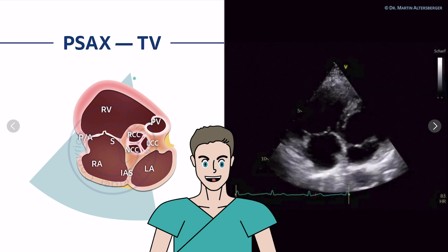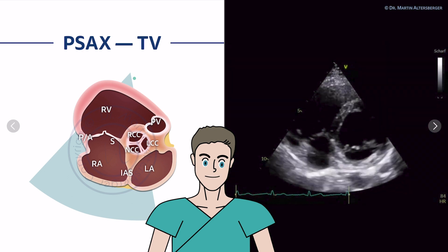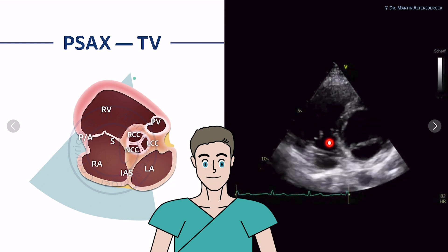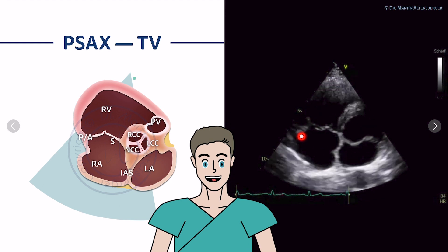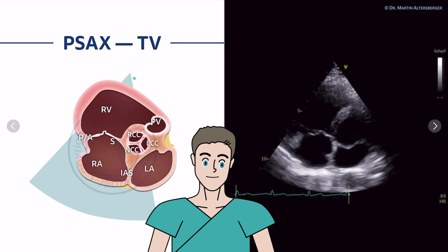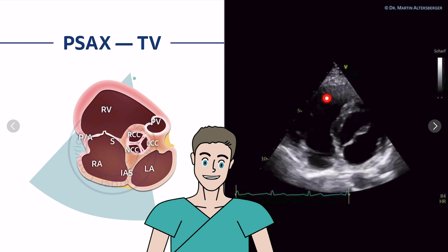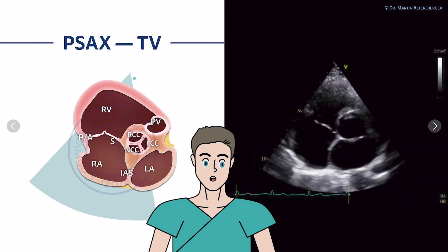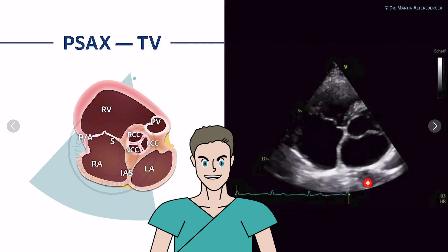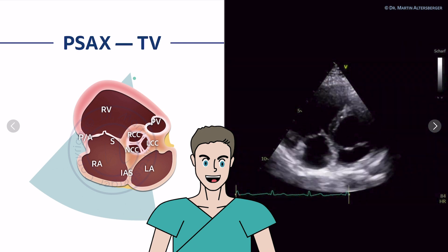With the tricuspid valve, it's important to differentiate the leaflets. In this case, we see the septal leaflet and the posterior or anterior leaflet, depending on how you angulate the transducer. Here we have the right ventricle and the right atrium; the pulmonic valve is not seen in this view. As a side note, the descending aorta can be seen down below.